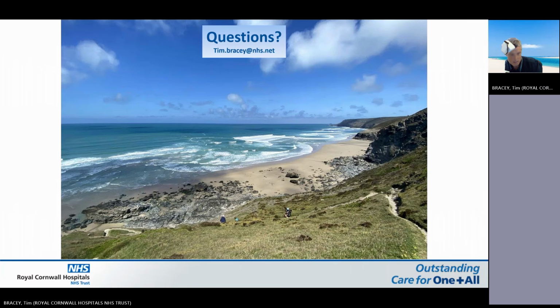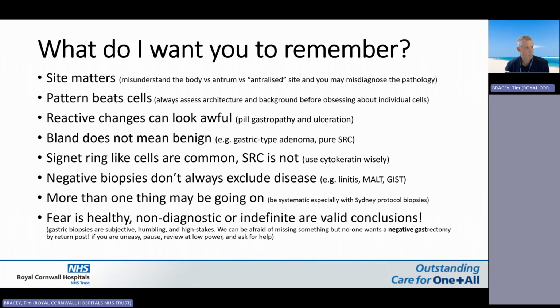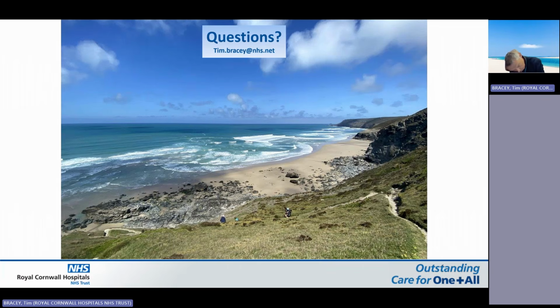The AI, I've got to say, was, I don't know if I did say, I'll probably put it in my introduction. There is a video of me on YouTube with all the cases that I gave. Well, actually, not all the cases. I gave it probably 100 or so really difficult cases. It didn't miss a single cancer cell. The problem with AI, well, there's lots of problems with it. It's incredibly expensive. It'll cost you as much as a colleague. All it does is say, this is suspicious, which we can do anyway.